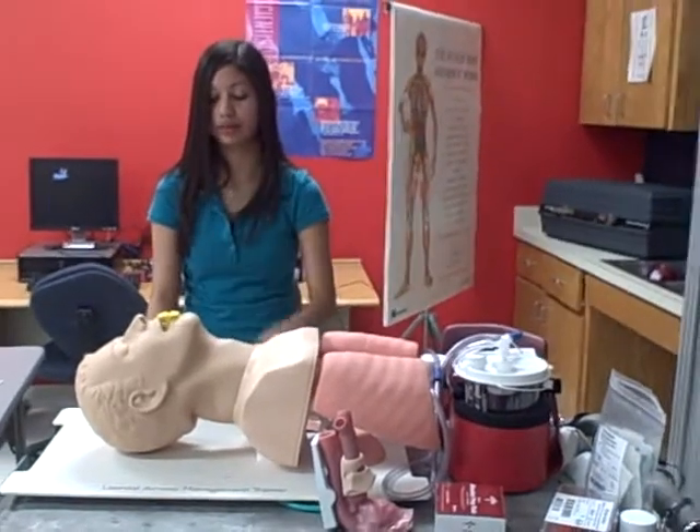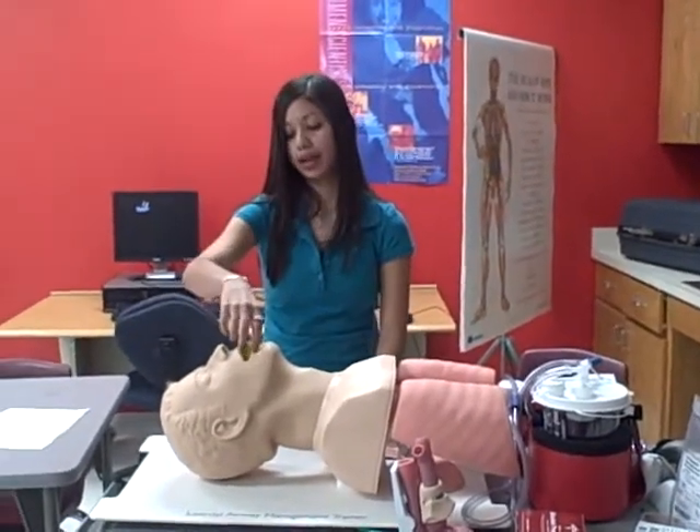Your patient is now conscious and is gagging. And I'm going to pull it straight out.